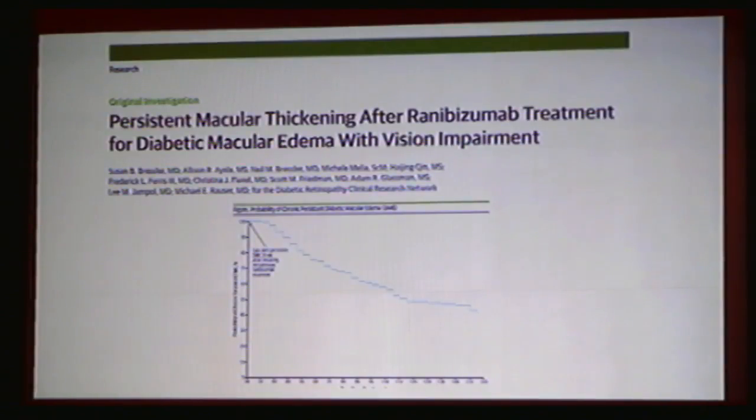We start treating several patients, and after 6 months, we call them all back into the clinic. We do a good quality spectral domain OCT, and we see that 40% of them still have fluid in the back of the eye. And we have all been through this situation, having almost 50% of your patients saying, how come I've been doing such an effort? The patient has been doing such an effort, 50% of them are happy with the treatment, and the other 50% are not that happy with the treatment because they may have a thicker retina than expected.